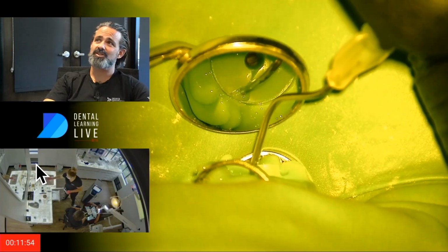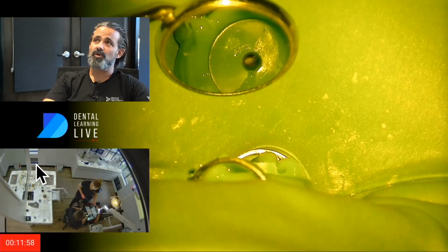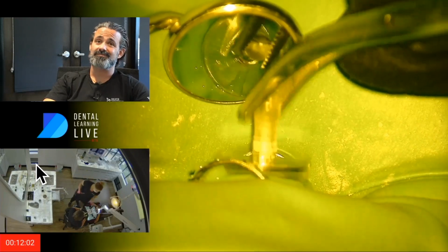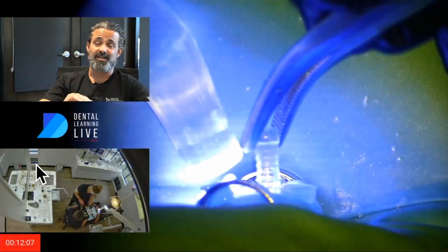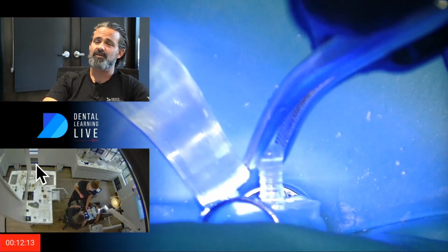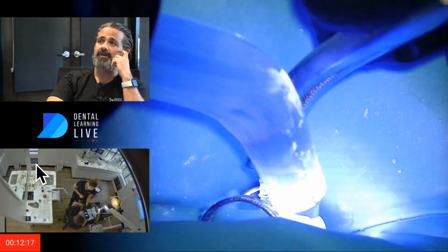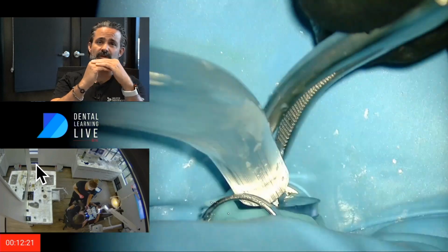And sometimes that's why I like showing these things, just to show you that whatever your temperament is, do it your own way. I know that still probably would have worked, but maybe not. So no probabilities here. I'm just going to place that platform back. I did not pre-cure it. I flushed it, and then I'm just going to seat it down and give it a go. You can go a little light on that, or excess will push back around the matrix. Or if you just want to impression it in, just go a little light.